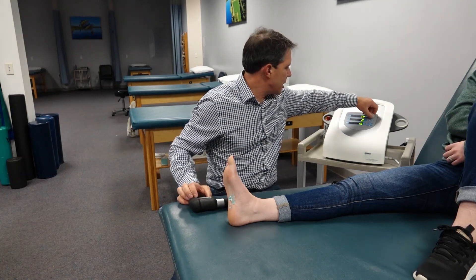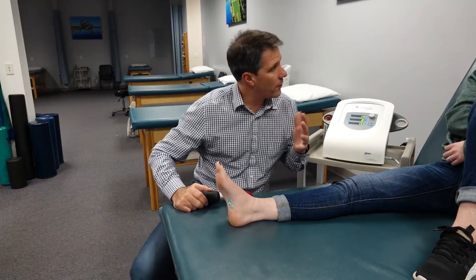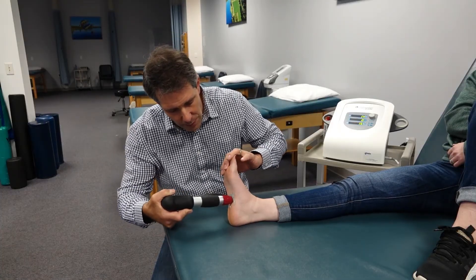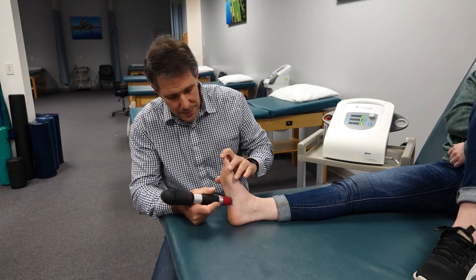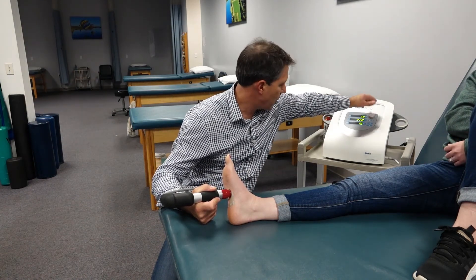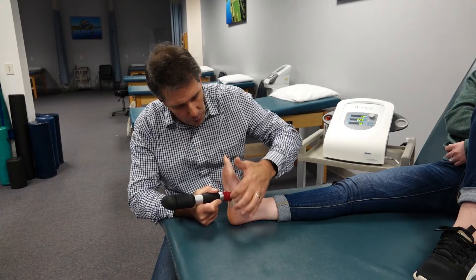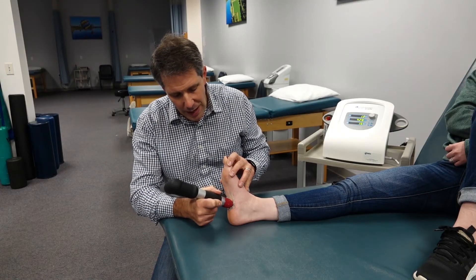I usually like to start a little bit on the lower side so you can work it up and find where you want to be in terms of intensity. We want this to be like a four to five on the pain scale, zero being no pain and ten being the worst possible pain. We find our location and start it up — as you can hear, it does make a little bit of noise. You can get right on that fascia, and we ask the patient their pain level to make sure we're right where we want to be. We can work that whole tissue, the whole fascia, or focus near the calcaneal tubercle if there's a really tight location.